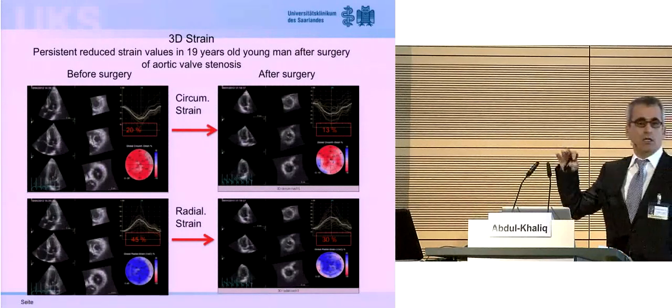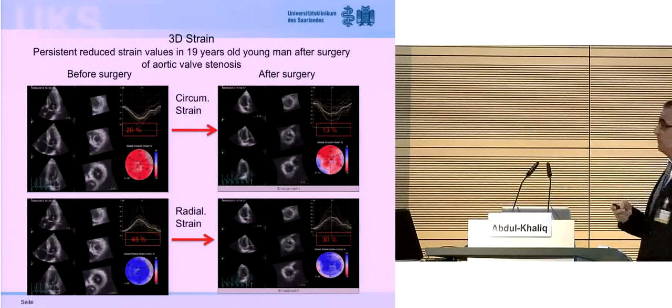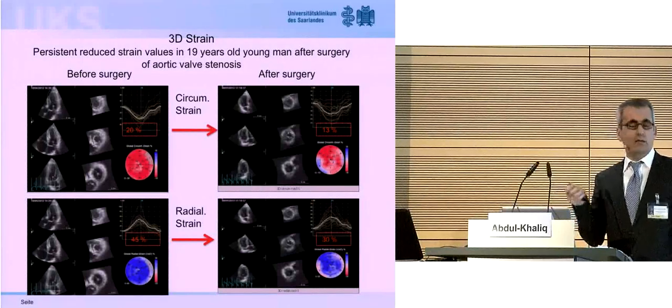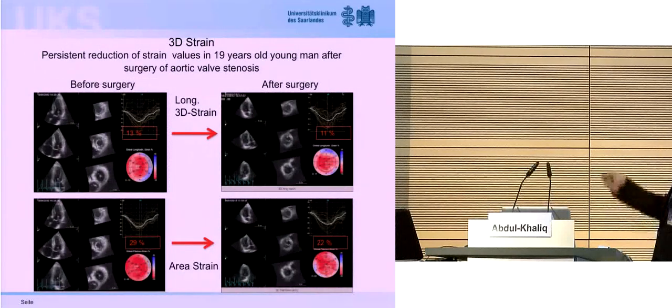We are now repeating this study, looking at pediatric patients before and after surgery. And you see what we have seen, that we have a persistent reduction in myocardial function. I think these patients still need more time to recover. All of these patients have a normal ejection fraction. And this is also concerning the longitudinal strain and area strain. They have a reduction of these parameters after surgery.